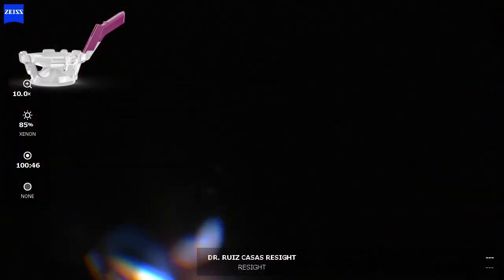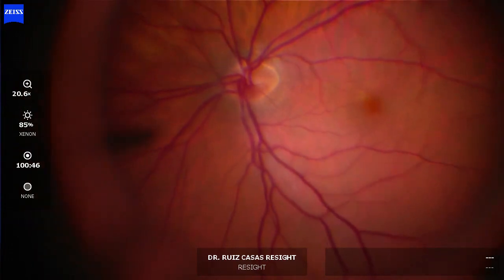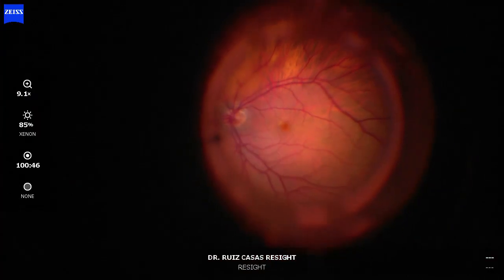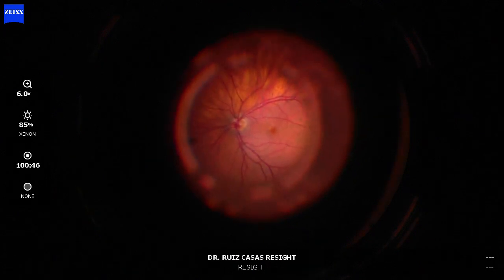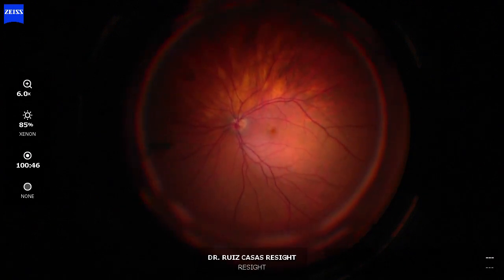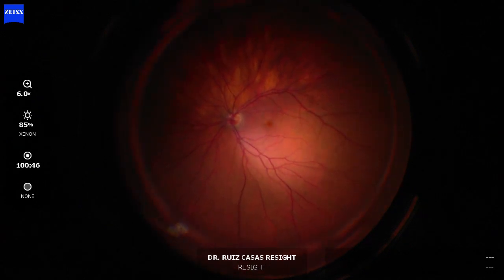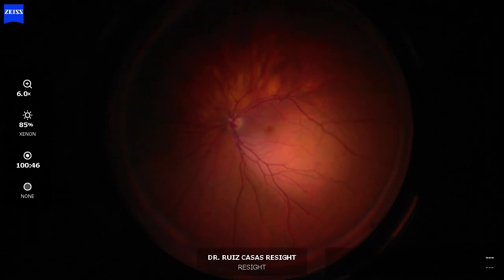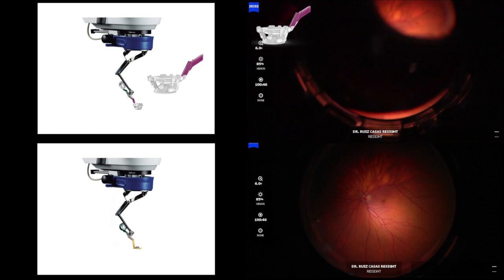And I'm comparing with the new disposable ultra-wide field. It is a new concept, new design. The macular view is worse because once you tilt the lens a little bit, you have some kind of diplopia. But the peripheral view, as you will see afterwards, is excellent — it's massive. It is not that different from the normal non-disposable yellow one, but I think that you can reach 10 degrees more peripheral during the surgery.